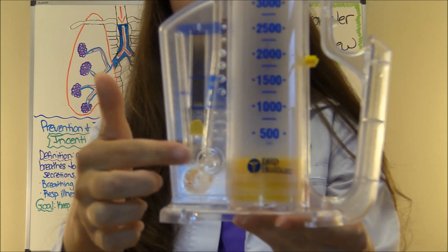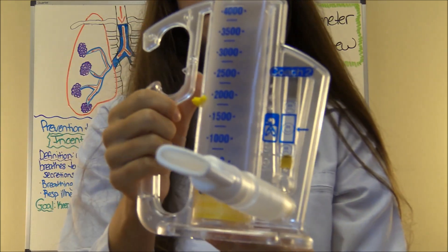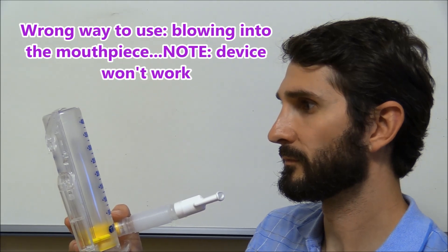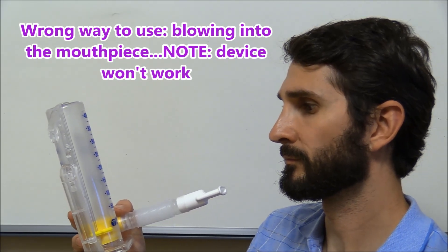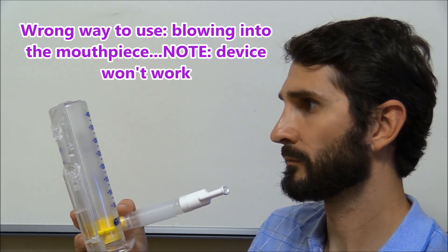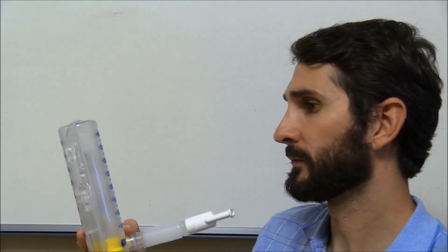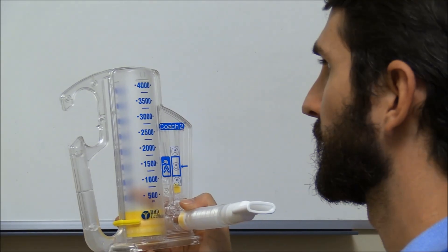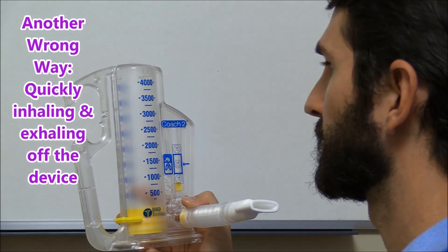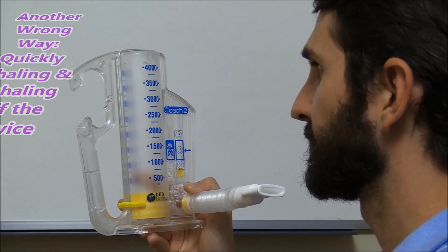On the back, some models have a little oxygen port where you can connect oxygen if the patient is on supplemental oxygen while they breathe. Now let's go over some wrong ways to use the incentive spirometer. Patients who haven't been educated properly may blow into the device rather than inhaling from it. Another wrong way is by quickly inhaling and exhaling rapidly off the device.